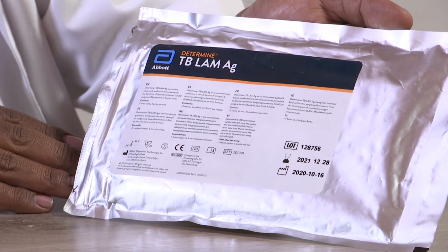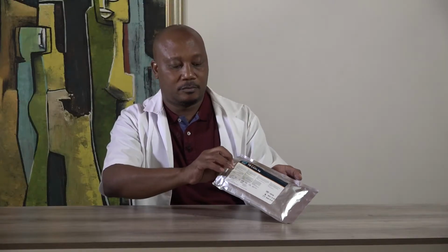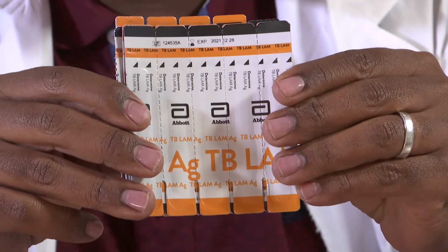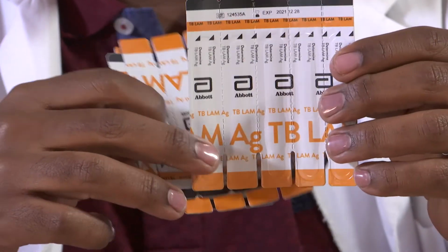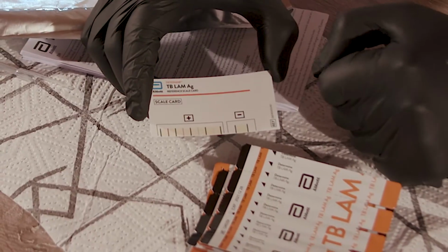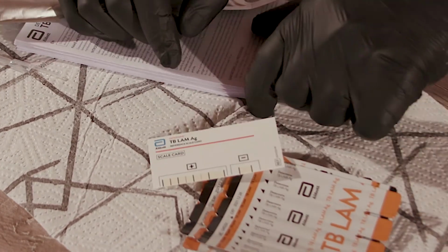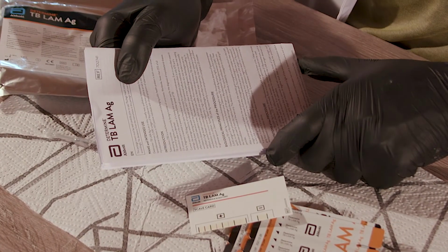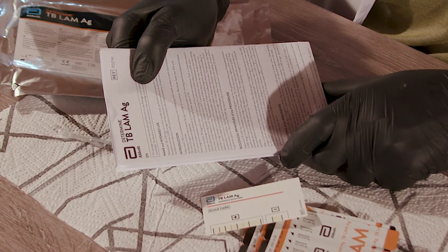I will now cover the contents of the test pack and the material that is required for testing. Number 1, you have 25 TB LAM AG tests in 5 cards, each holding 5 test strips. Number 2, you have a TB LAM AG reference card. Number 3, you have one TB LAM AG instruction for use form.